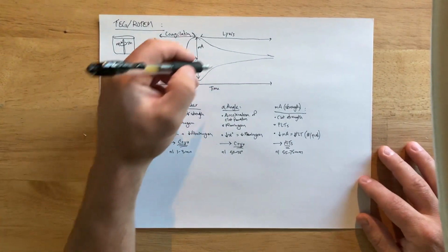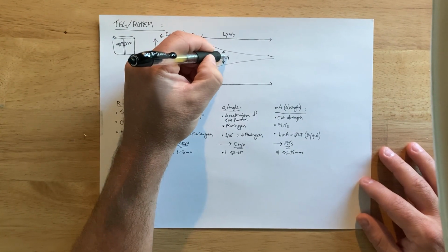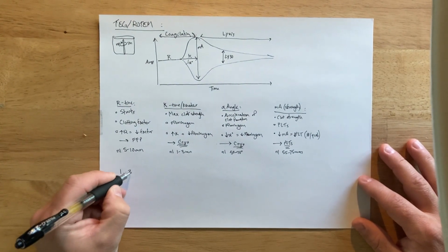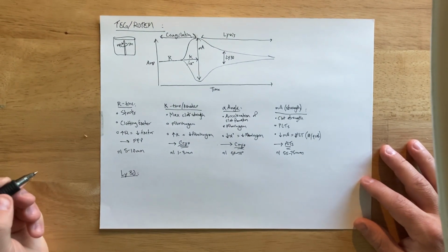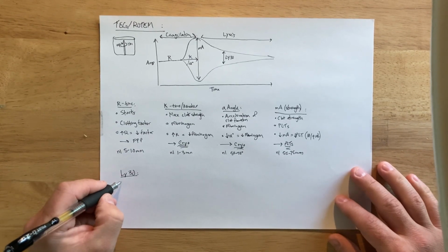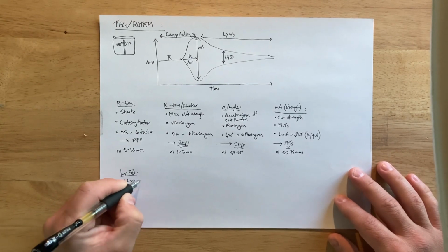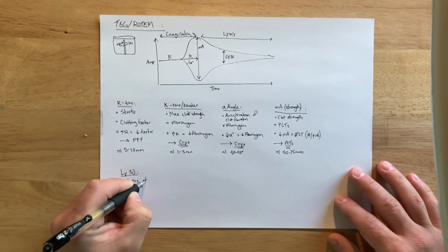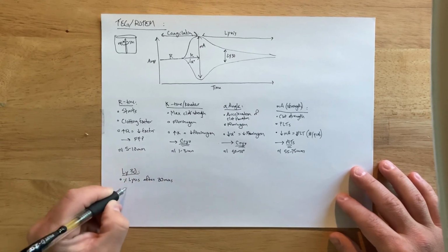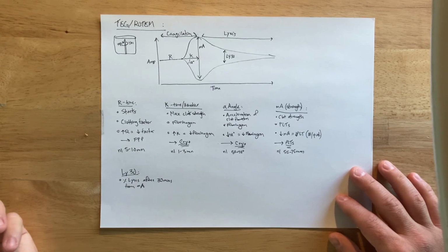Now, on the lysis end, you have a measurement called LY30. Okay? This is the percent lysis of the clot after 30 minutes from your maximum clot strength.